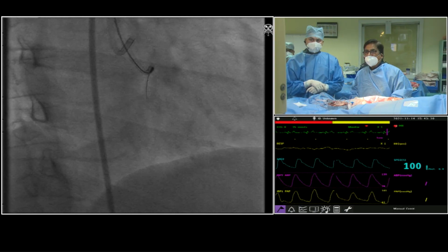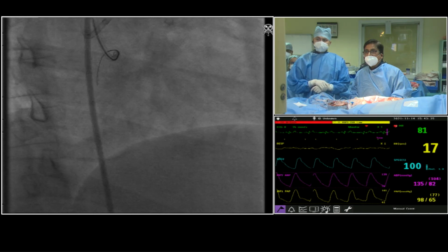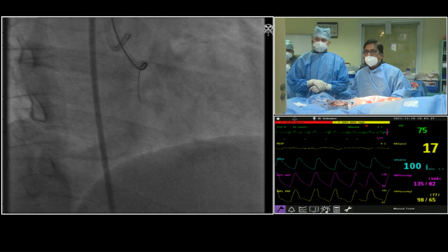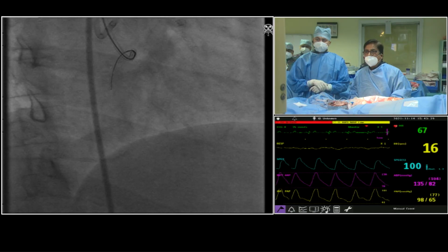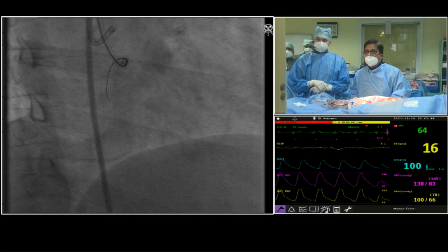What is this called? He has a cath lab which is actually having a biplane. Biplane cath lab. Sorry, I'm not getting the word. Actually, becoming old, Pratap. So the wire seems to be moving in a good direction now. Very good, very positive now.